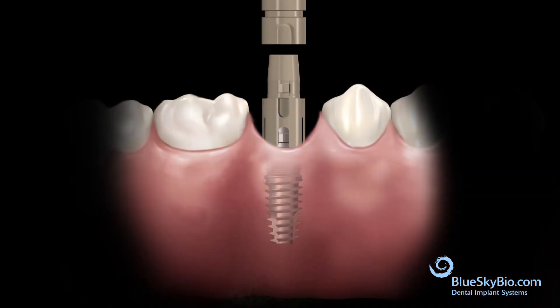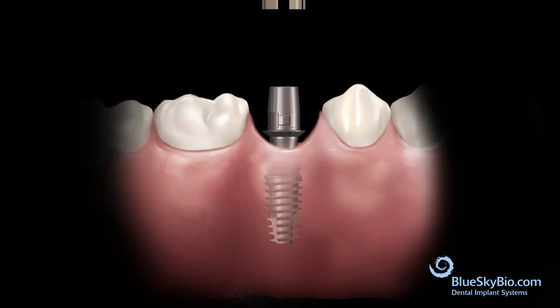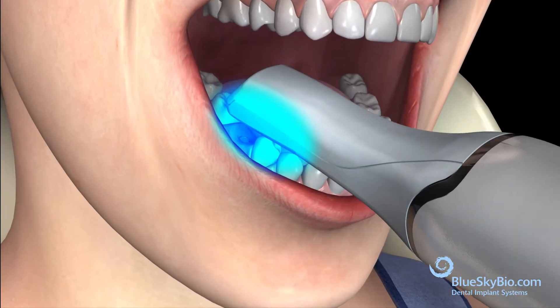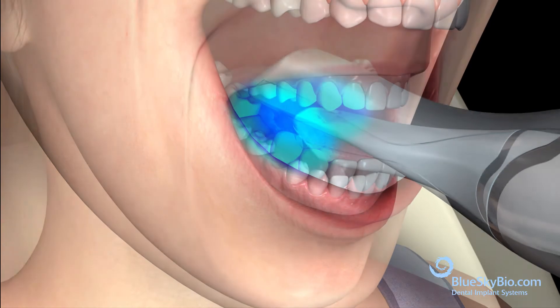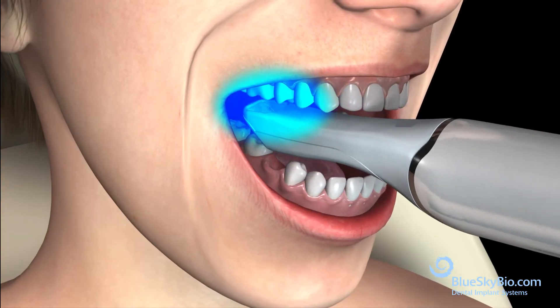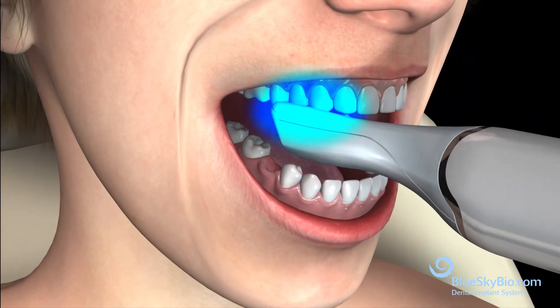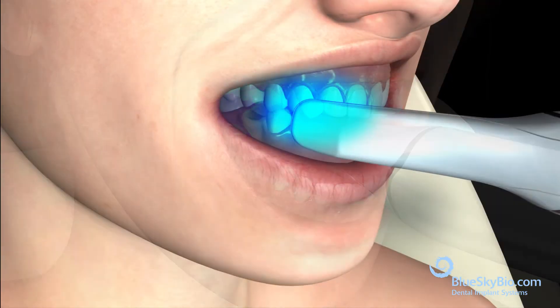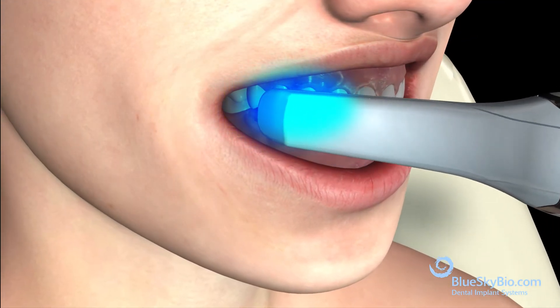Remove the scan post assembly and the titanium base abutment. Scan the tissue directly over the implant to capture the soft tissue geometry. Scan the teeth of the opposite arch. Scan the buccal surfaces of the teeth in occlusion.